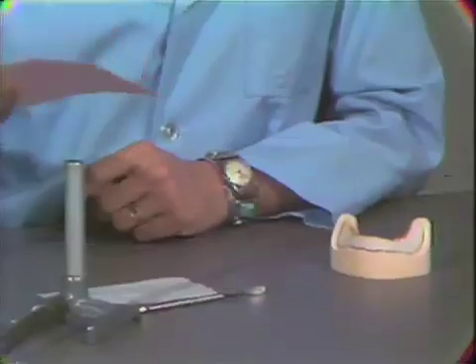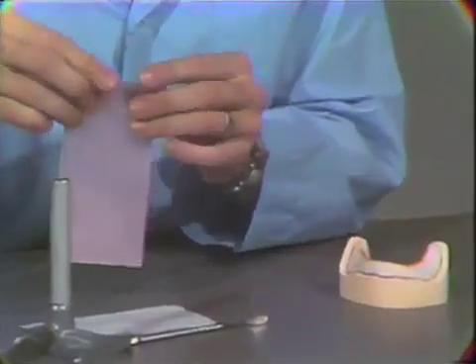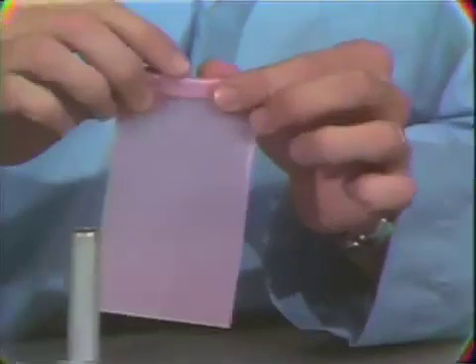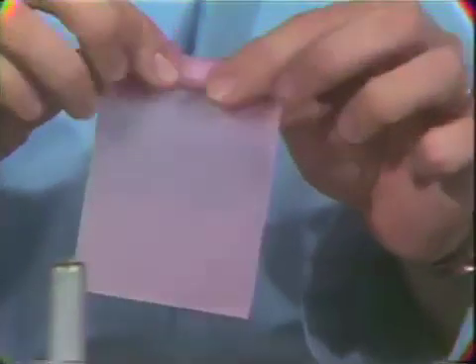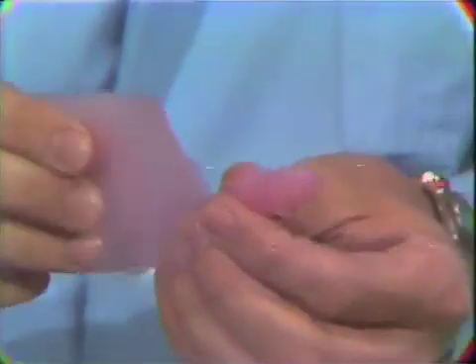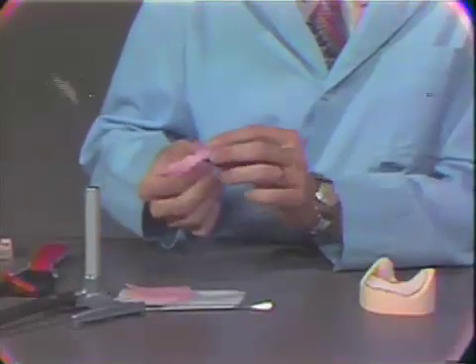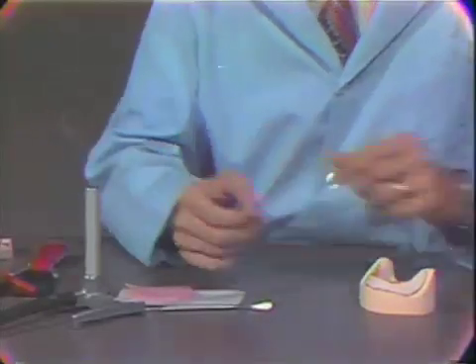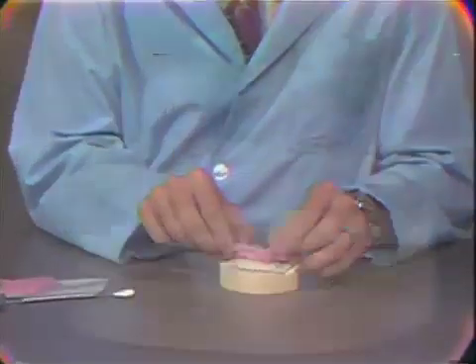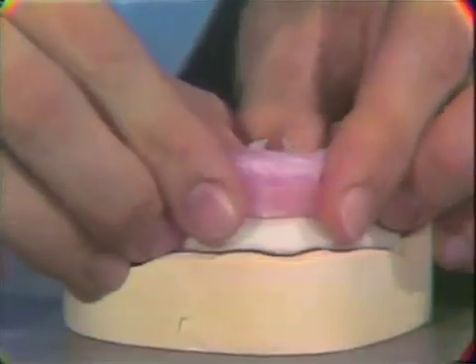A full sheet of pink base plate wax is gently warmed in the Bunsen burner, warming both sides, and very carefully it is rolled into a cigar shape. It usually takes approximately two-thirds to three-fourths of this sheet of wax to form the wax occlusal rim. It is uniformly heated so that it may be bent and molded with your fingers, and then it is attached to the base plate over the top of the sticky wax and formed.